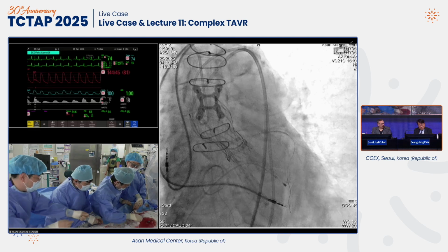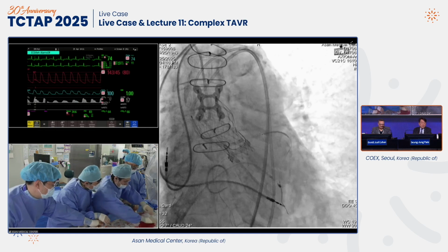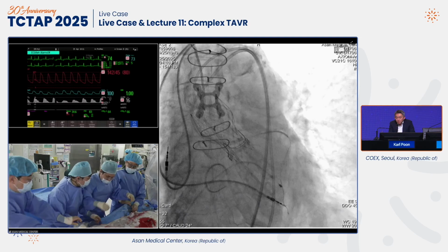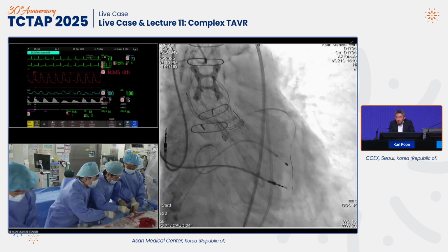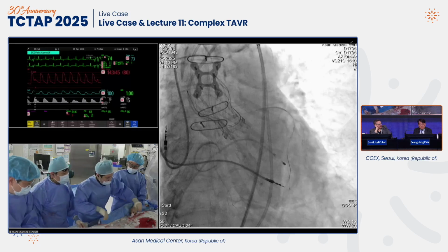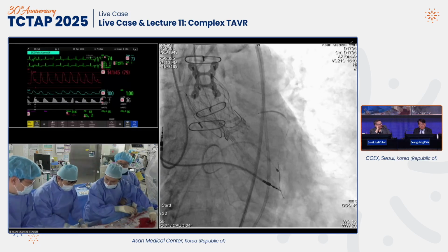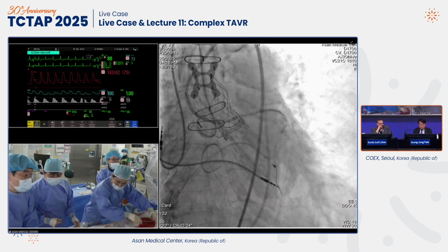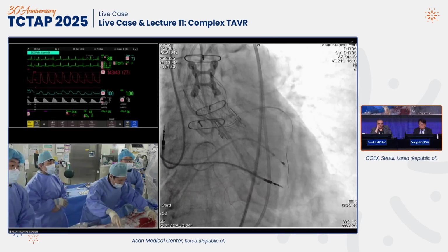If there's no coronary obstruction in this case, do you think this demonstrates a limitation of CT prediction sometimes? Well, CT prediction isn't about saying it's definitely going to obstruct. It's just saying it's high enough risk to consider doing something that you can do safely. Don't measure with the coronary, measure directly with this. It's going to be very close.